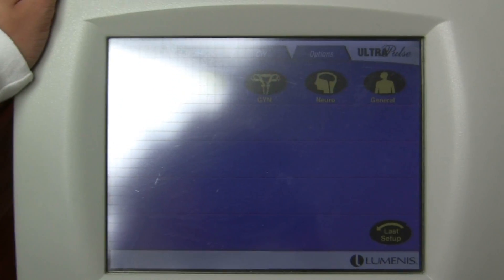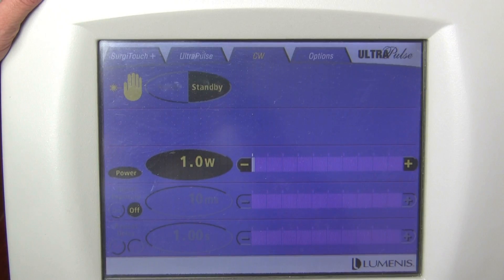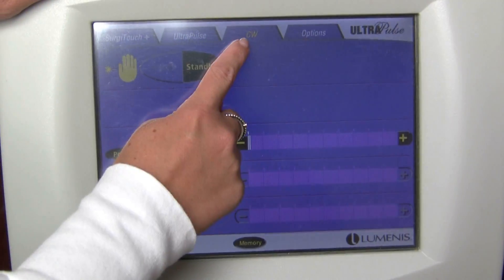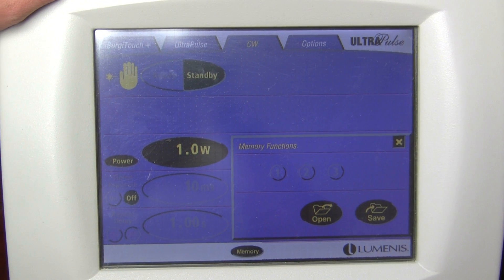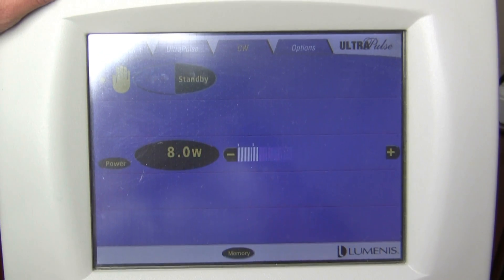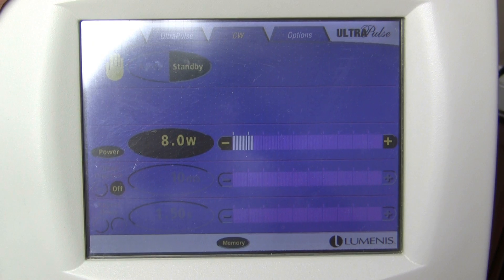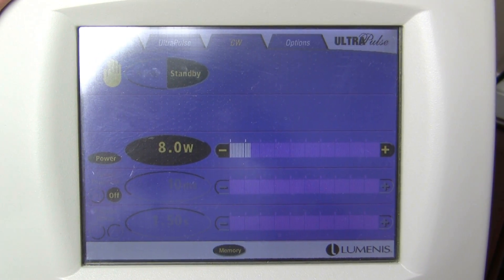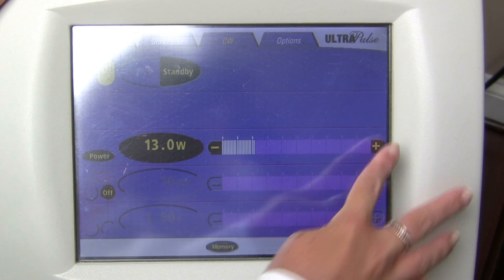We pan over to the screen. Alyssa is showing us how to set up for the cutting wand handpiece. You select CW at the top, then all of our settings are saved in memory — memory open one — and as you can see it is set to eight watts. If for some reason it is not there, you just hit the plus sign to the right and move it up to whatever number is needed.